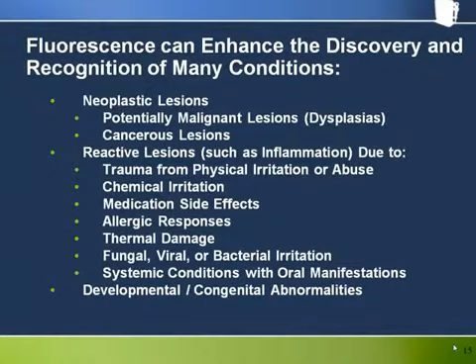Trauma, chemical irritation, side effects from medication, thermal damage, fungal, viral or bacterial infections, all of these will probably be more noticeable through the Velscope, mostly because of the associated inflammatory response. Note that persistent inflammatory lesions in the oral cavity can be symptomatic of a systemic condition which, if left undiagnosed and untreated, can be life-threatening for the patient.